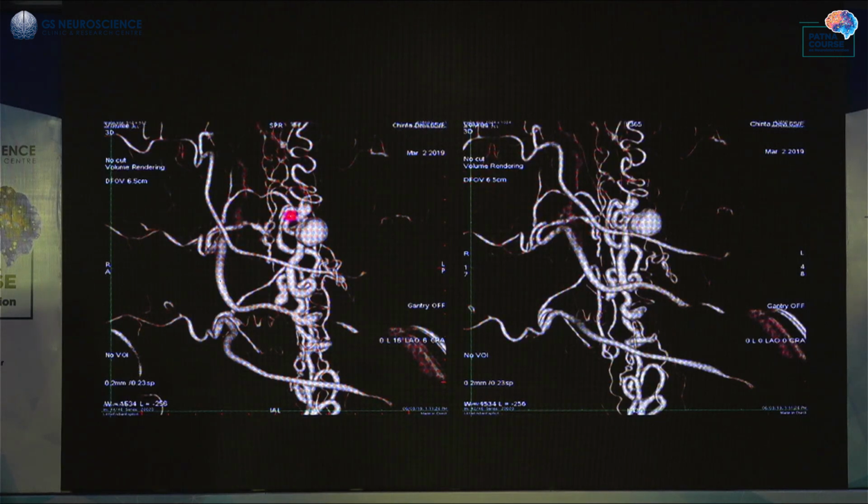So whenever you are trying to deal with these fistulas, you have to be double sure that your embolic material does not enter this sac. Because the moment you close the fistula, the sac will thrombose and go away. But if you fill this sac with a large amount of embolic material, the mass effect will remain. So the compressive myelopathy will not improve. So when you are dealing with these cases, you have a very, very short area that you have to disconnect.